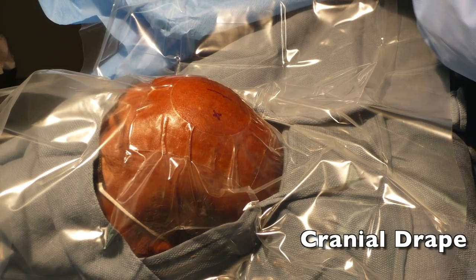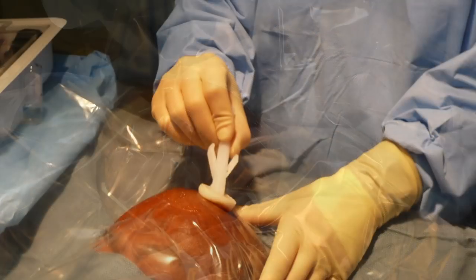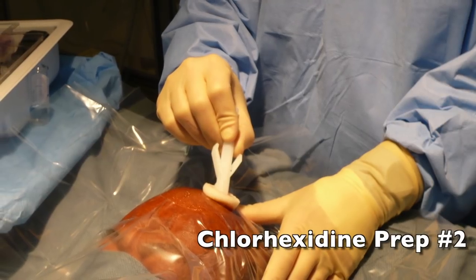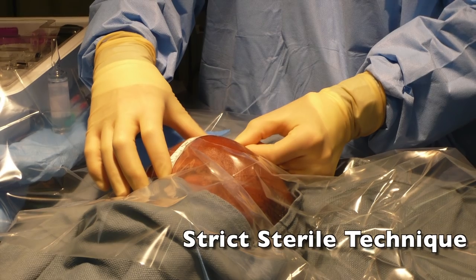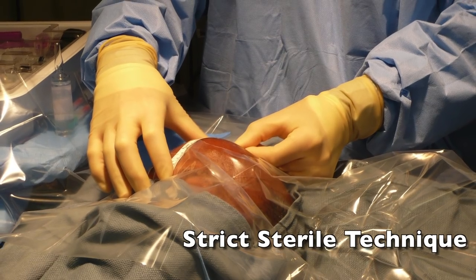A transparent cranial drape is then applied. A second chlorhexidine prep is then performed. Throughout the procedure, the surgeon uses strict sterile technique.